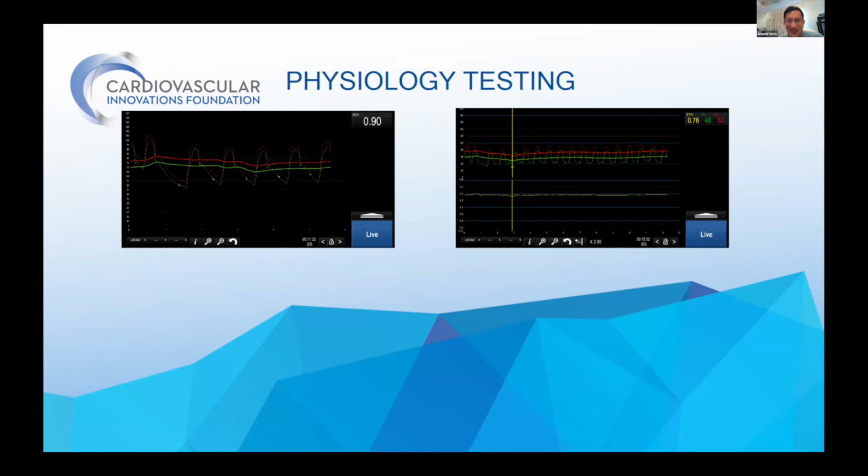Yeah, this is a great case. I mean, you had a borderline negative RFR, you had a borderline positive FFR, you actually had a firmly negative CFR, and then you used coronary imaging along with the physiologic testing non-invasively to help push you towards the intervention. I really think it becomes dealer's choice in these matters when it's in these intermediate ranges, and you use your best clinical judgment. Stick with the patient who has symptoms. This patient has symptoms. You talked over what he should have, and you thoughtfully went through his options. So I think you did a great job, and I'm not sure I would ever go to aspirin desensitization, but that's another topic of conversation.